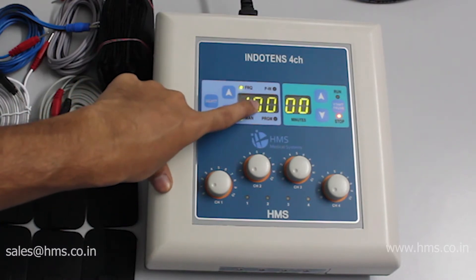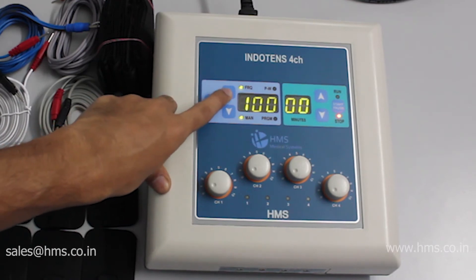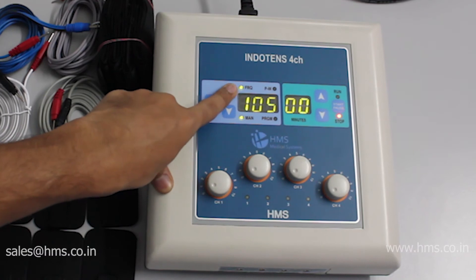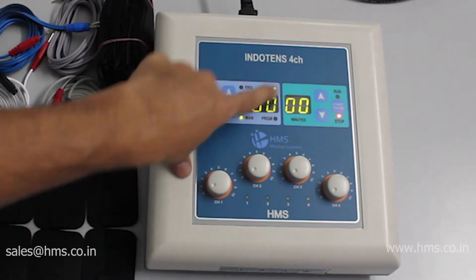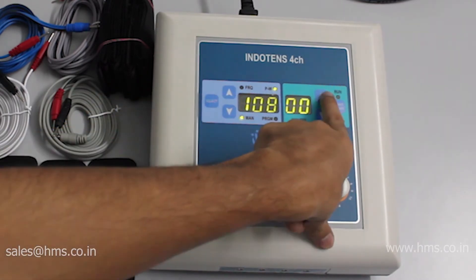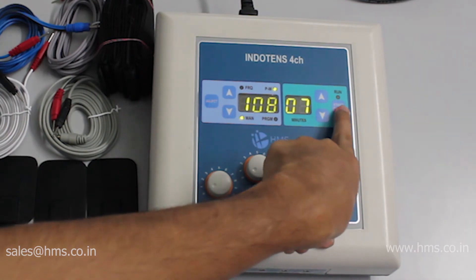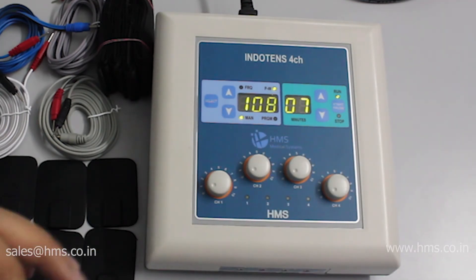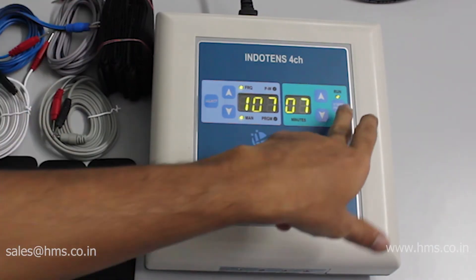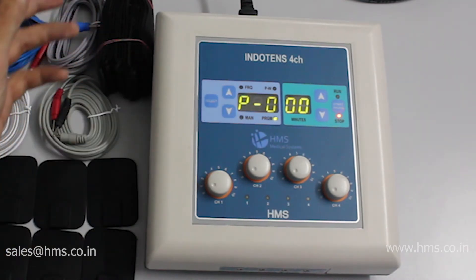After selecting program zero, you can set your desired frequency. Then go to pulse width mode and select your desired pulse width. Next, set the timer, and press the start button. After starting, the machine will begin to give the treatment.